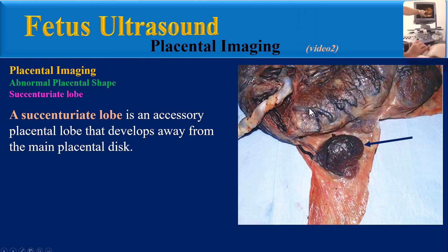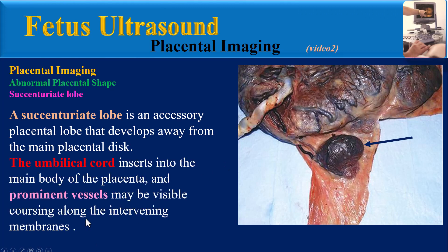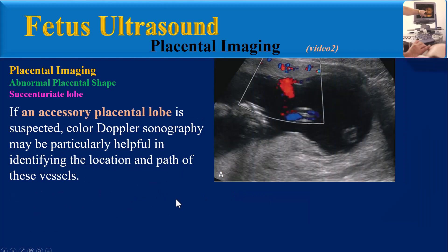A succenturiate lobe is an accessory placental lobe that develops away from the main placental disc. The umbilical cord inserts into the main body of the placenta, and prominent vessels may be visible coursing along the intervening membranes. If an accessory placental lobe is suspected, color Doppler sonography may be particularly helpful in identifying the location and path of these vessels. In this 20-week gestation, the umbilical cord inserts at the main body of the placenta, which is implanted anteriorly.